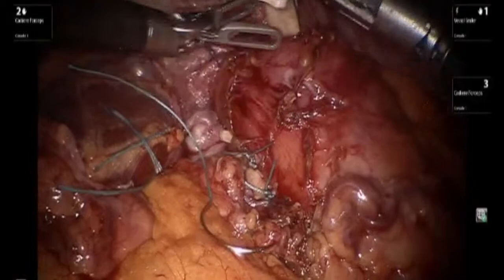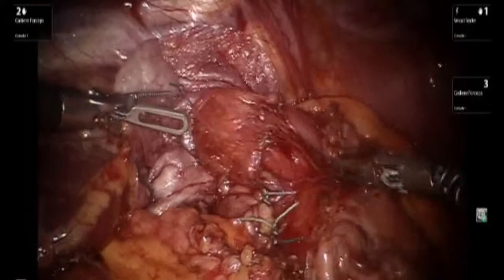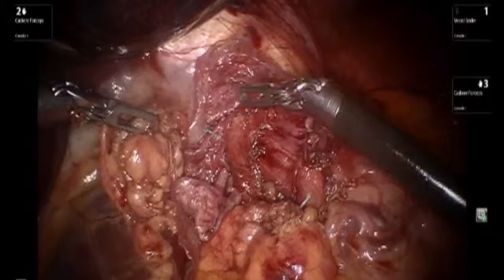The Penrose drain is removed and the hernia closure is re-inspected. The mesh is tucked away in the proper position. Thank you for your attention.